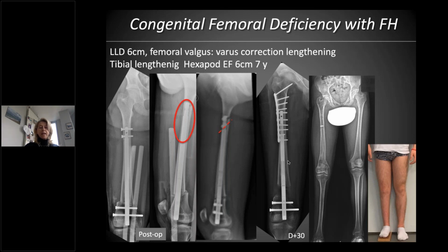in some cases, like here, when the femur is short and the medullary canal is narrow, the retrograde reaming will fragilize the inner cortex of the proximal part, and the freehand locking technique can fragilize even more the bone, risking a pathological fracture, as happened exactly here at day 10, and I had to fix it with a plate. Anyhow, the patient in the end had a good result.